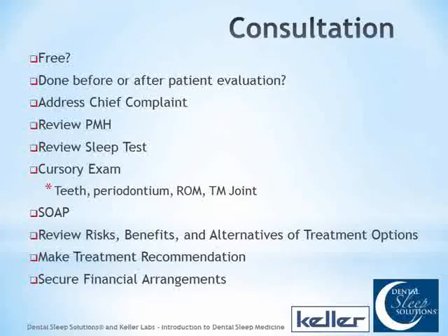Prior to the patient's arrival, we typically review the previous medical history. We review the sleep test. I go through it and highlight it. Now I've trained one of my staff members to do that and pull out the pertinent information, AHI, LSAT, and all the things we talked about in the previous webinars. Then we have all that information in front of us ahead of time.